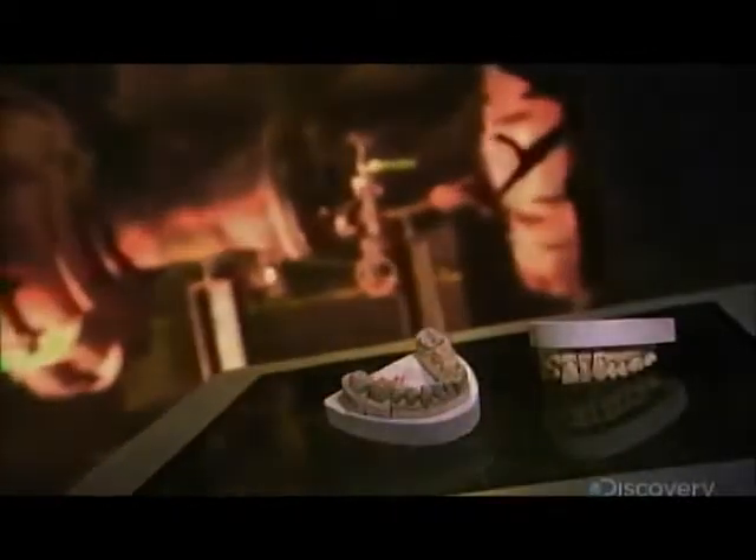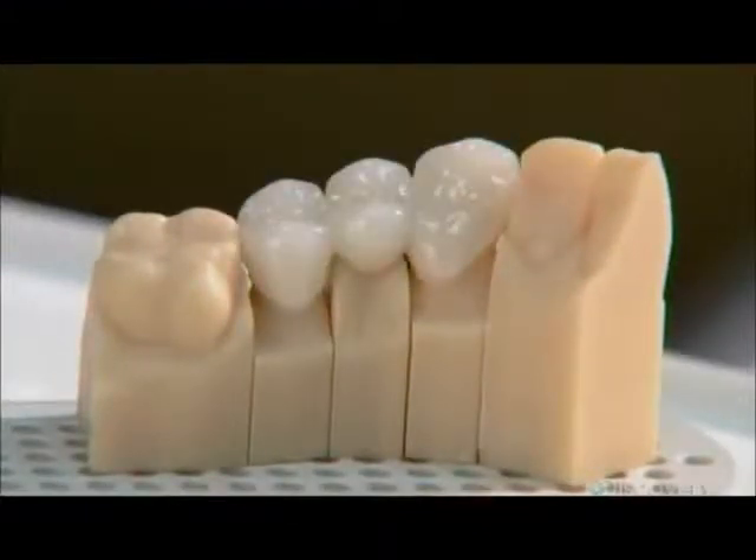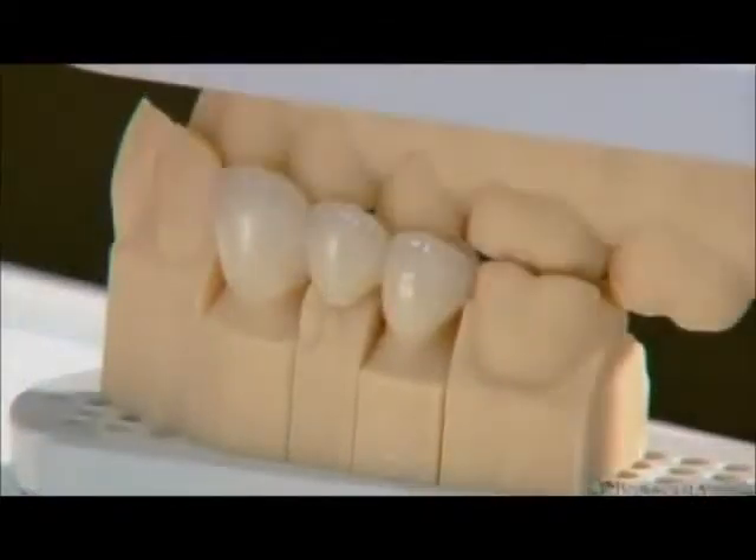For the patient, it means one appointment instead of two, and less time in the dentist's chair. With computer-driven tools, custom restorations take shape in a matter of minutes while the patient waits.